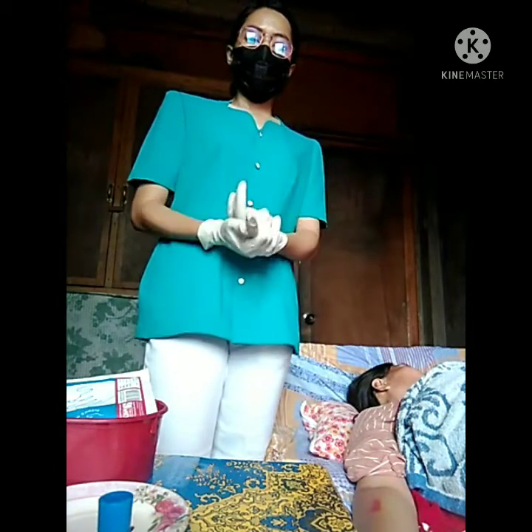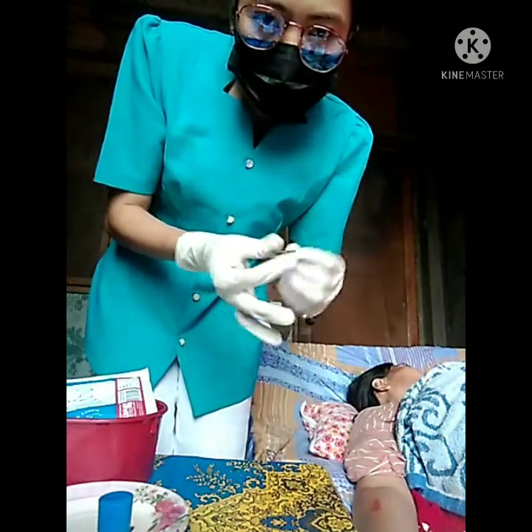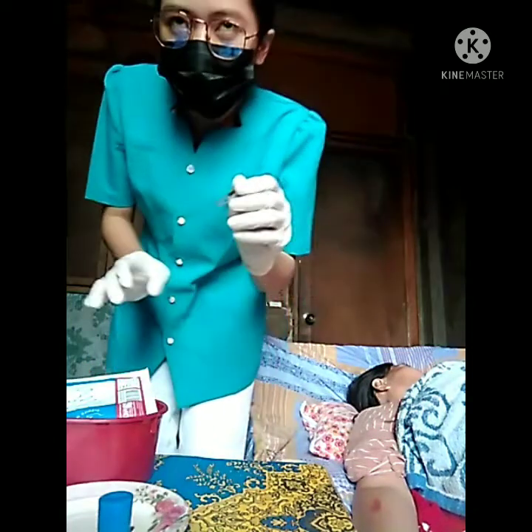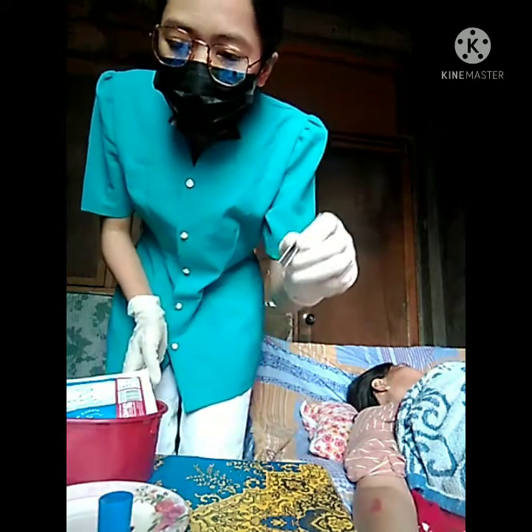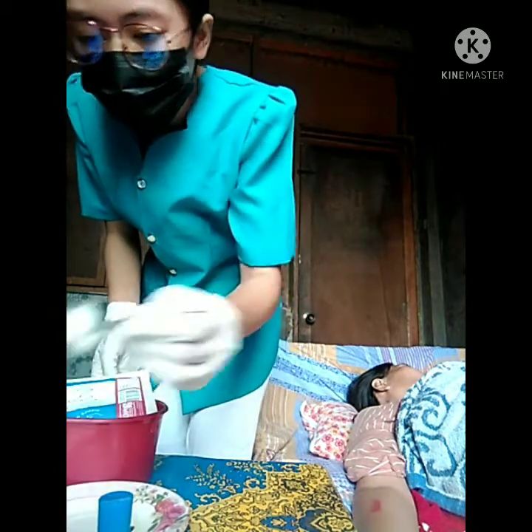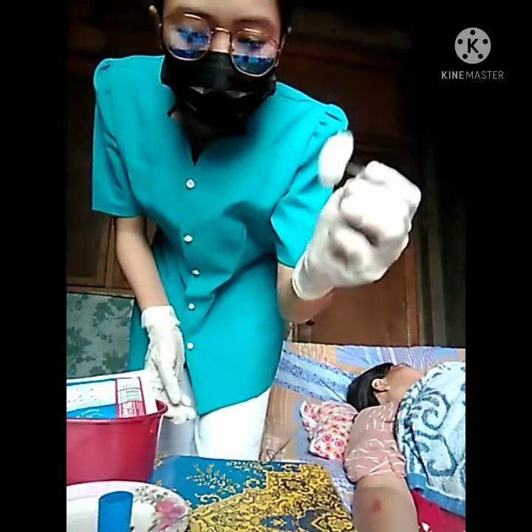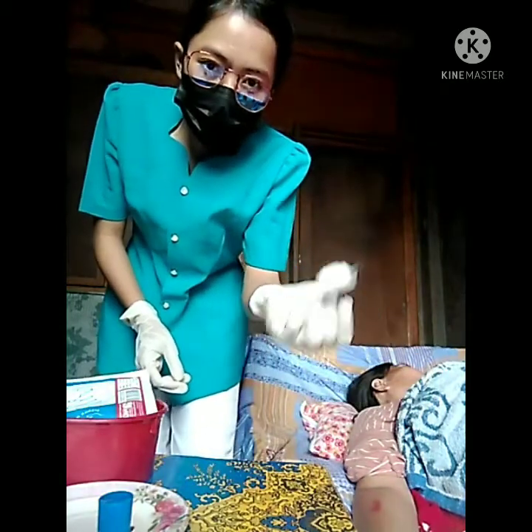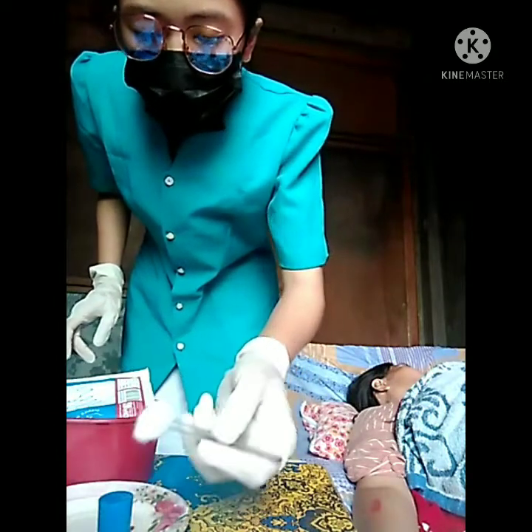We should use the sterile picking forceps. This is my alternative, or the improvised one. Then the cotton ball, and then put the betadine solution, as what I put in the small basin before.